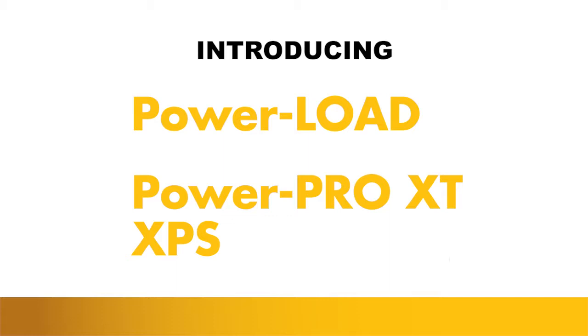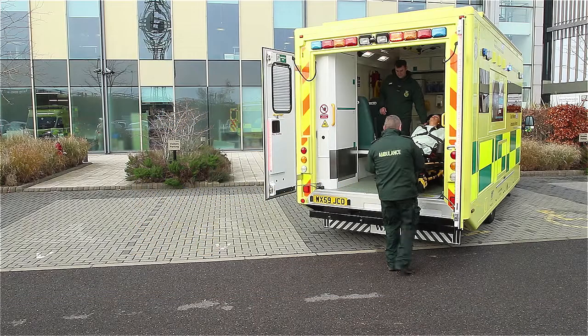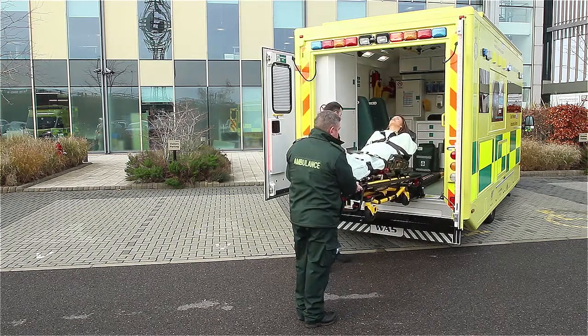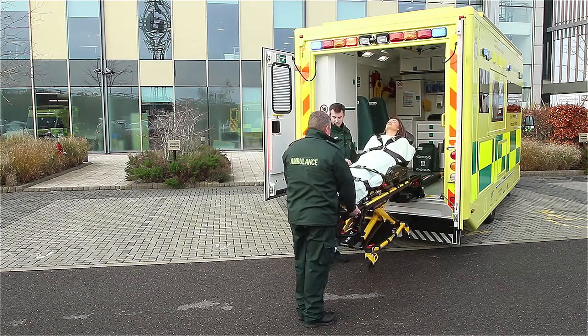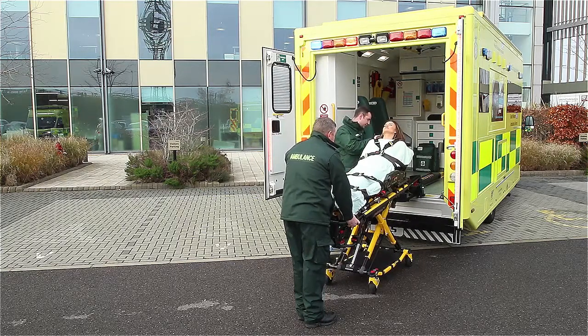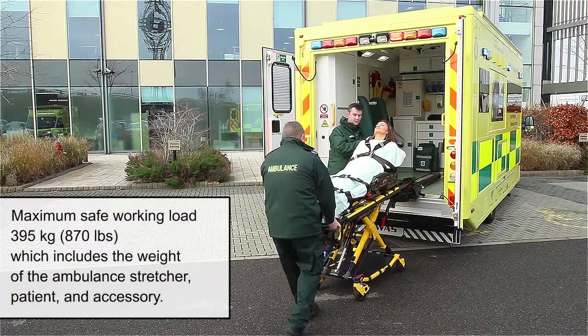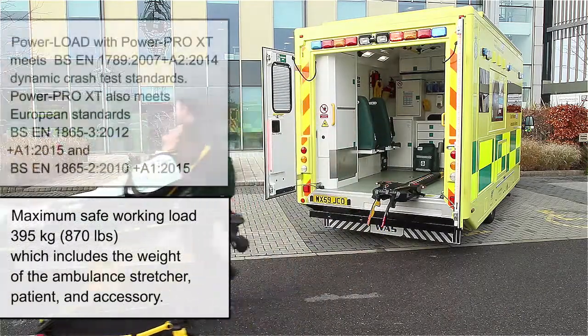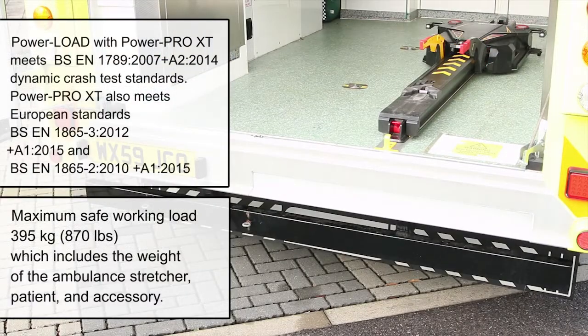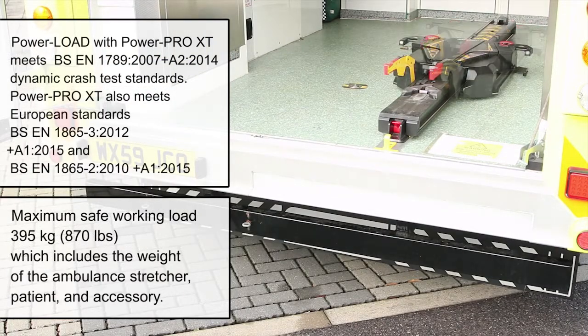Introducing the Stryker PowerLoad and PowerPro XT, a powered ambulance cot stretcher fastening system. The PowerLoad lifts and lowers the stretcher in and out of the vehicle and can help reduce spinal loads and risk of cumulative trauma injuries. The device has a maximum safe working load of 395 kilograms, which includes the weight of the ambulance stretcher, patient, and accessories.